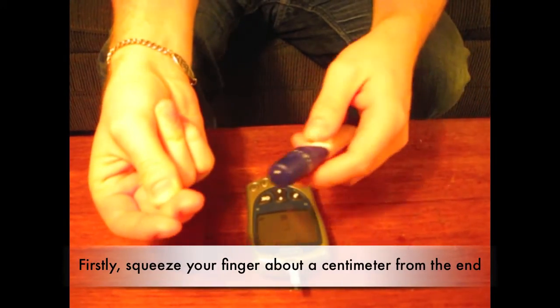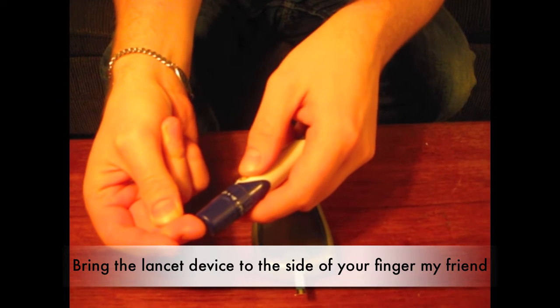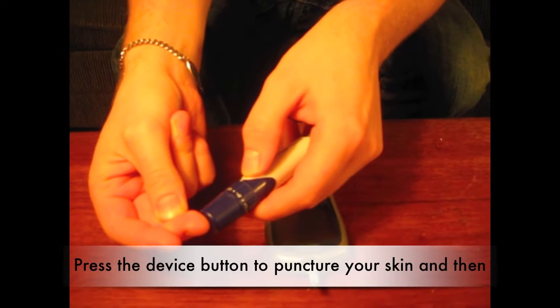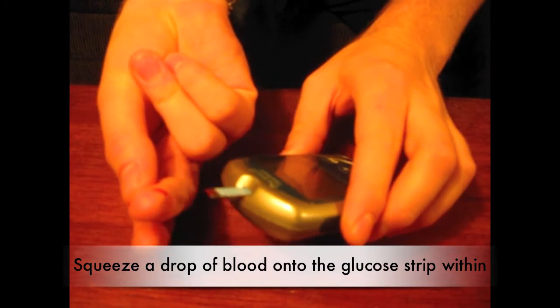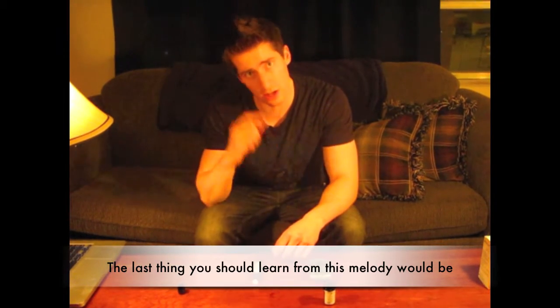Firstly, squeeze your finger about a centimeter from the end. Bring a lancet device to the side of your finger, my friend. Press the device button to puncture your skin and then squeeze a drop of blood until it reaches the glucose strip within.